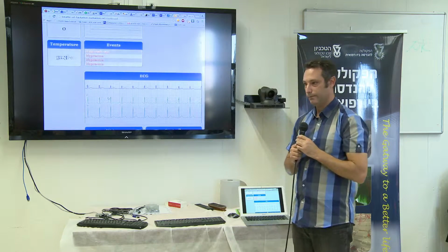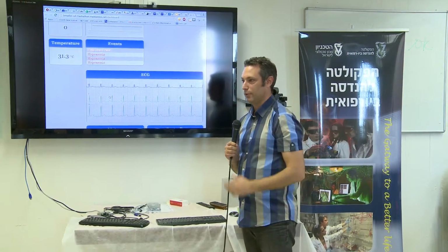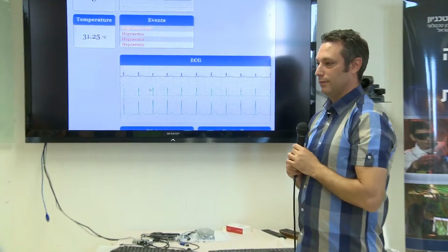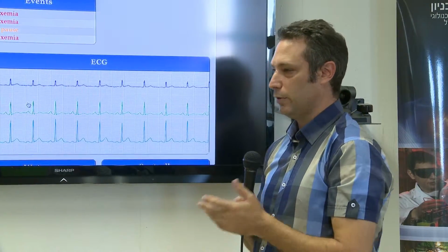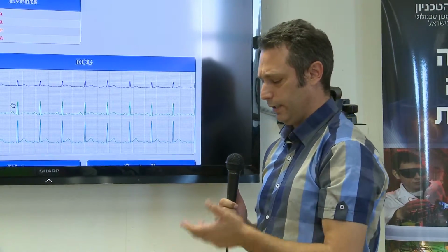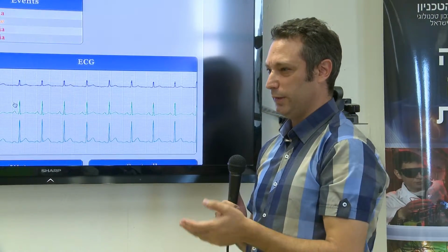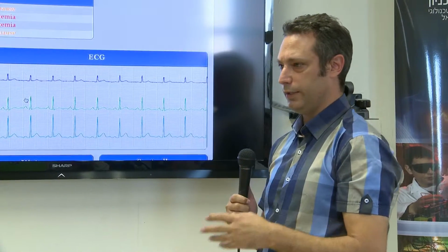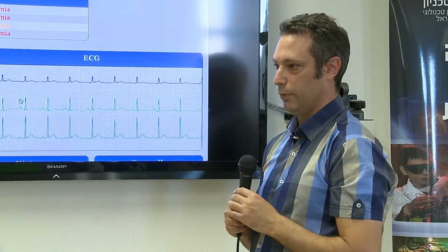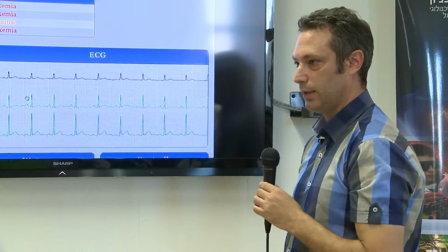So thank you. Yeah, sorry, question. Sure. Is that something that was developed here or prior? Yes, it was developed here. So we took basically open sensors that you can get, provided by Vitaly here at the conference. We connected them through our Arduino controller, and we upload them using the IBM Bluemix cloud.